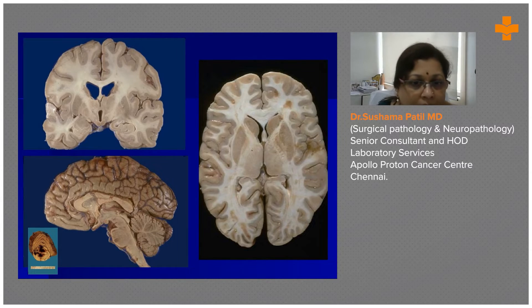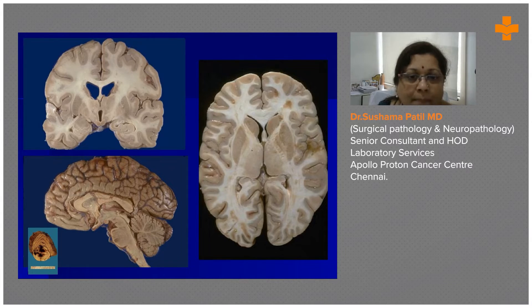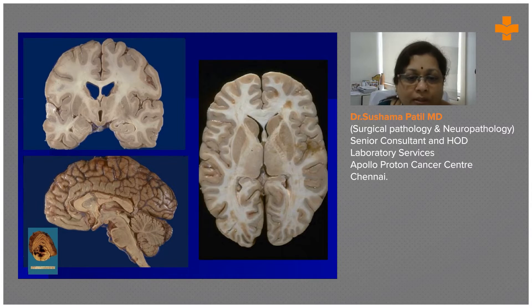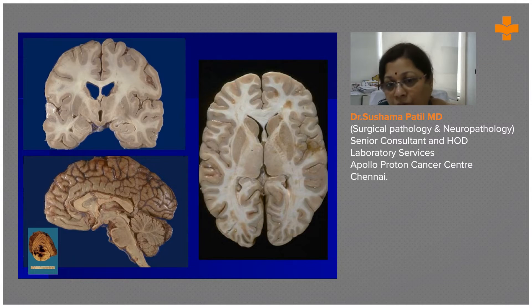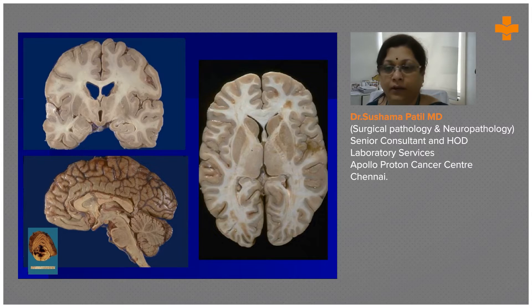The caudate is coming on either side. In coronal sections this is called the flat batwing sign. The structure immediately above the corpus callosum is the cingulate. These are important structures to know because when a tumor affects the temporal insular cortex, you should know exactly where it is located — especially since we don't get all these structures when assessing a sample at the grossing level.